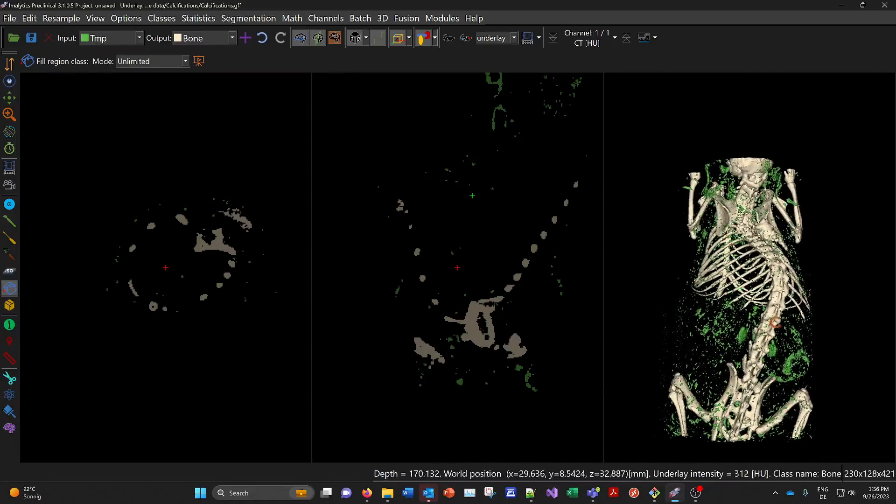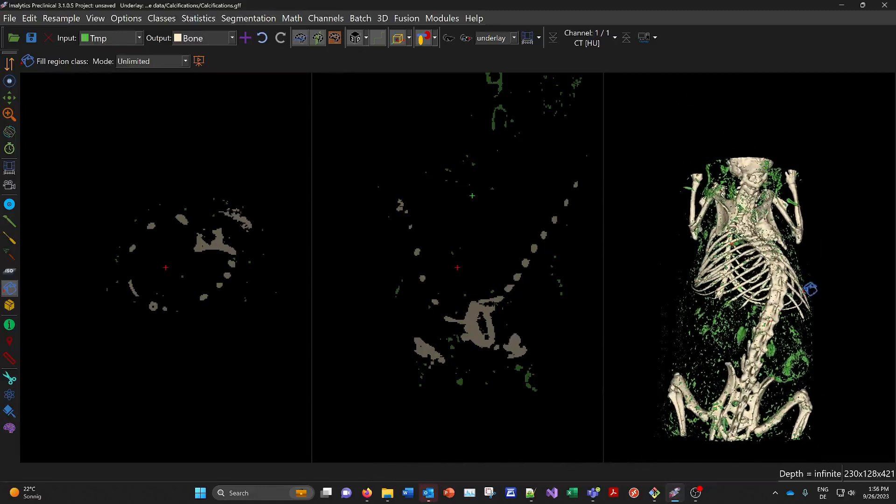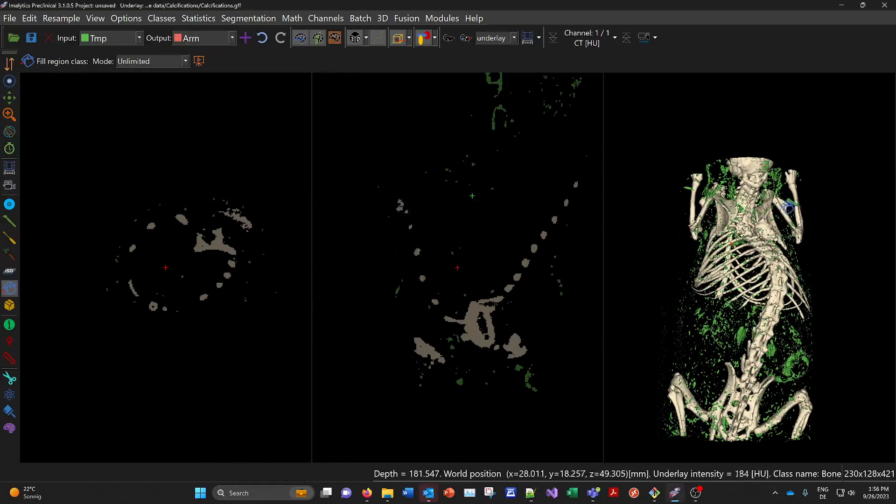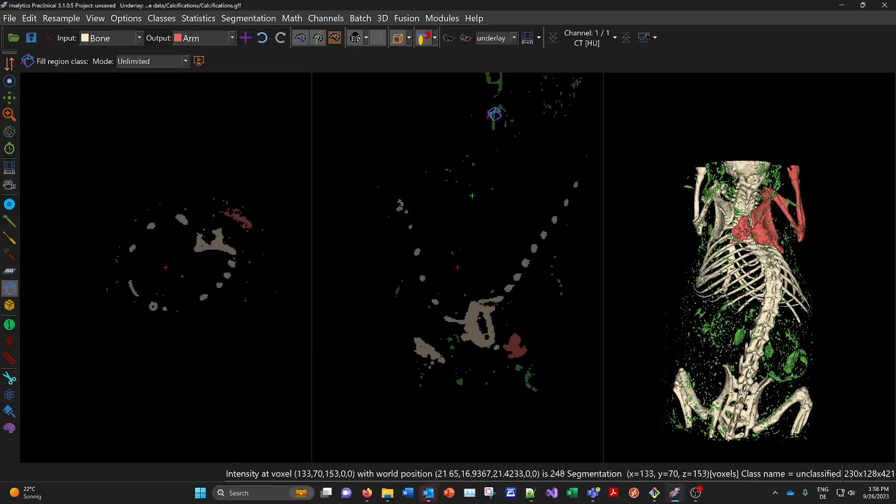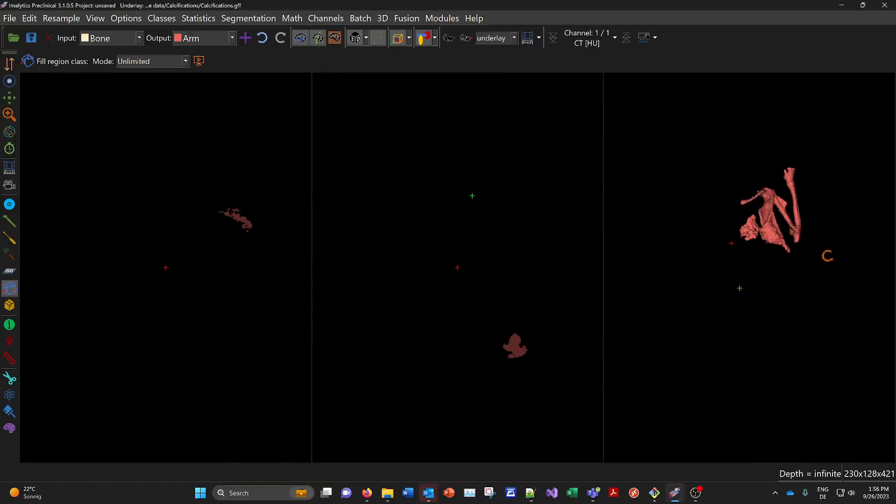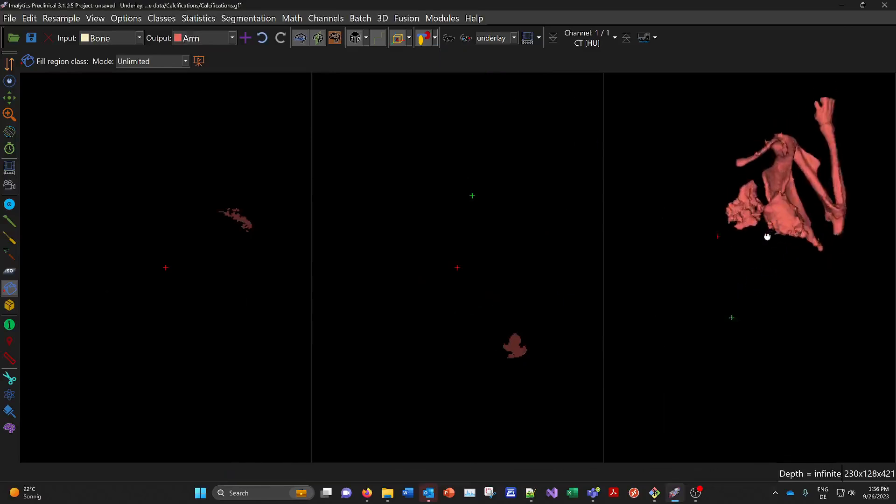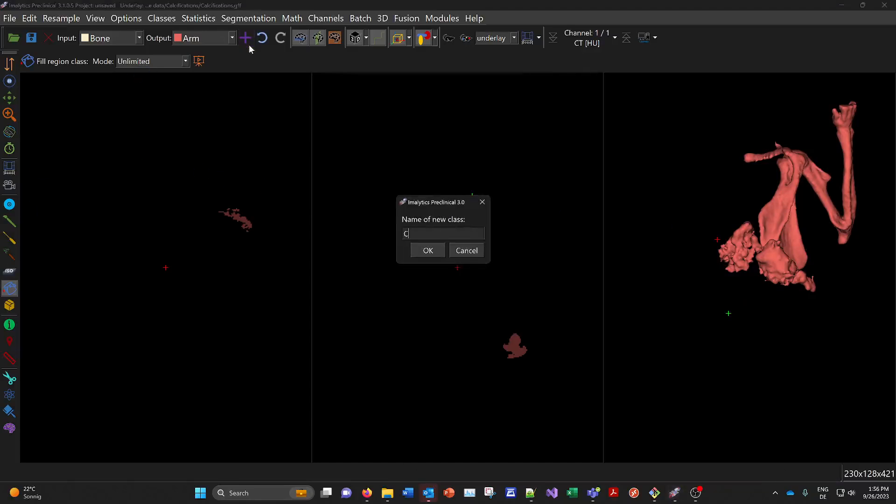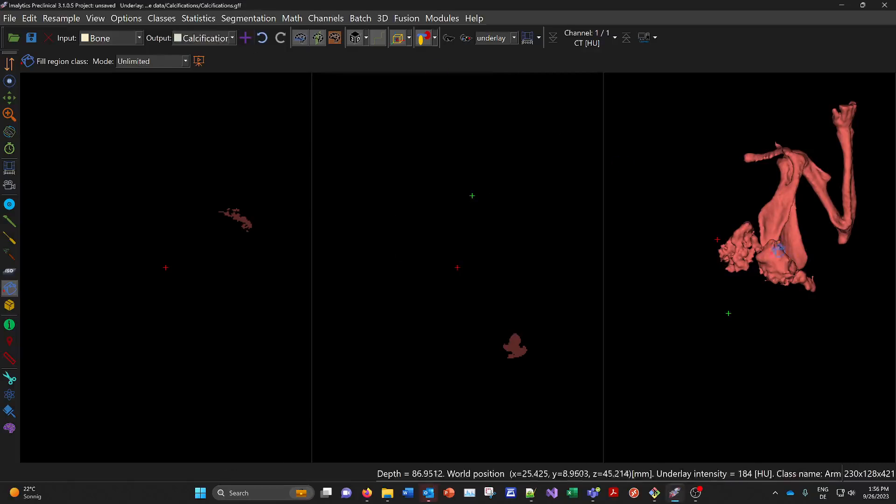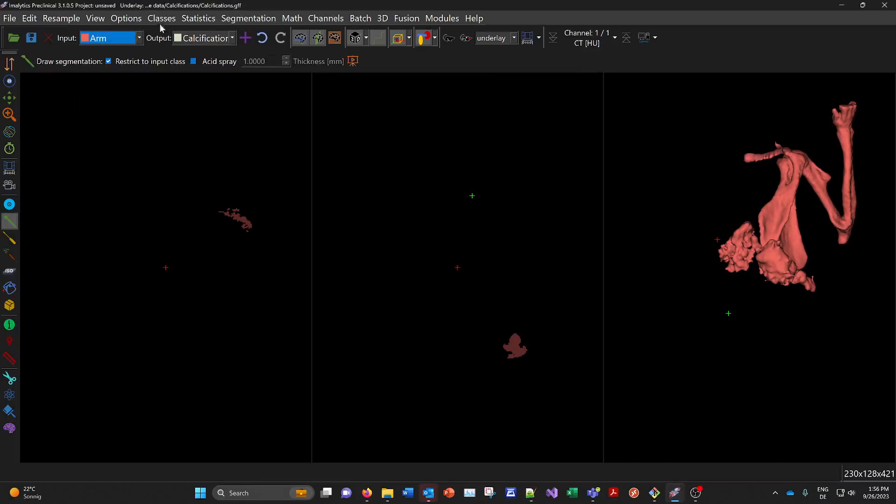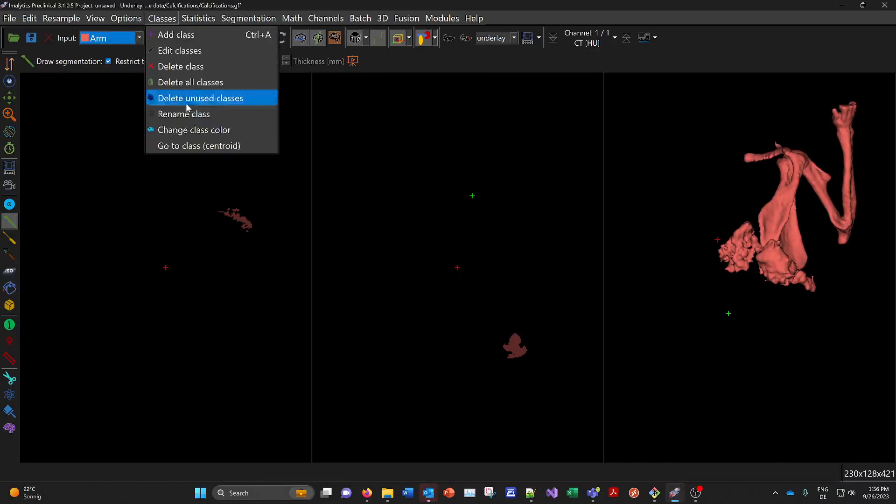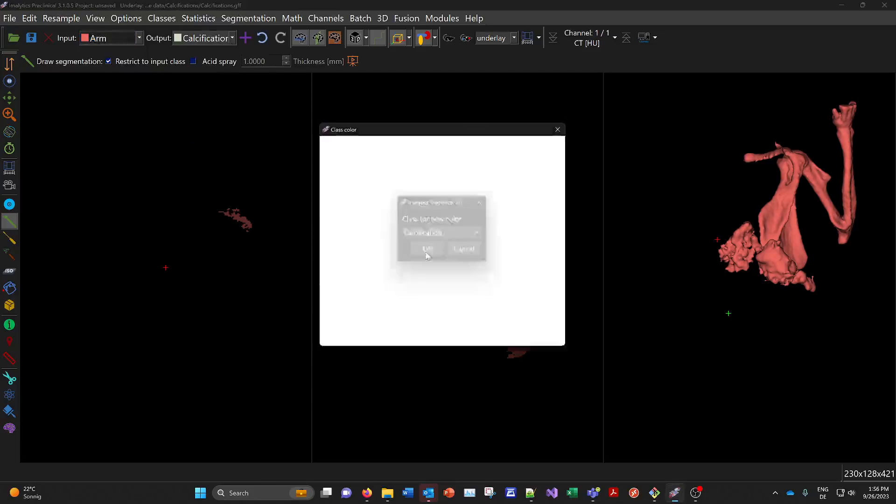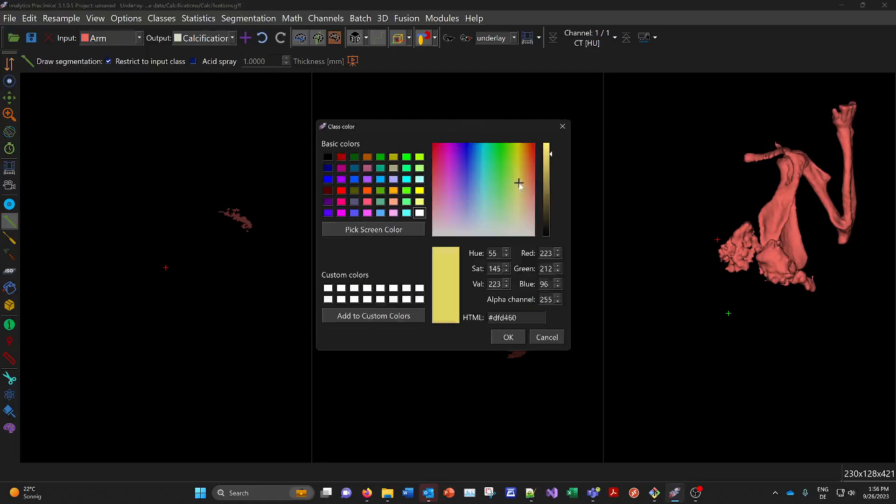And so I'll just for a moment add another class arm. Here where I put this arm in. And now I'll hide the bone class and the temp class. And I'll just try to catch here these calcifications by cutting. So I add a class calcification. So we need to use this tool here for example and go from the arm to the calcifications. I'll just change the color of calcification here to something like this.